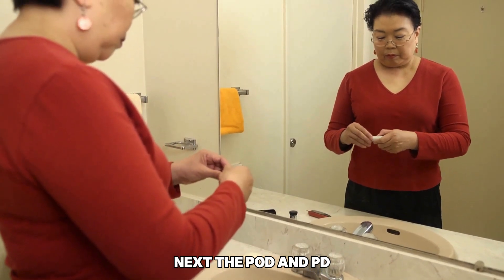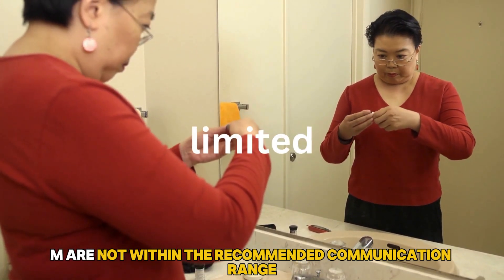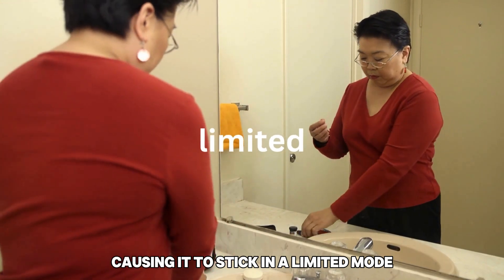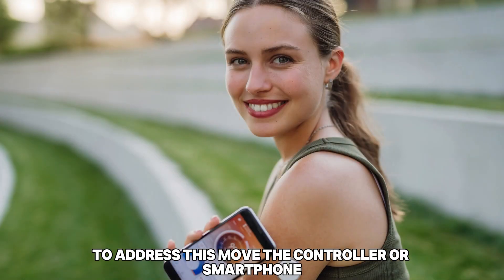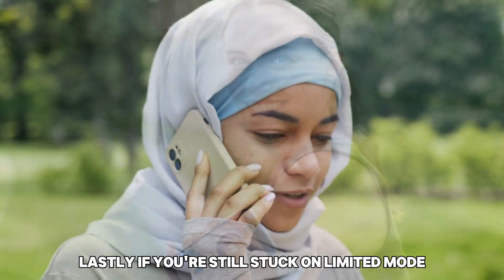Next, the pod and PDM are not within the recommended communication range, causing it to stick in a limited mode. To address this, move the controller or smartphone within 5 feet of the pod to re-establish communication.